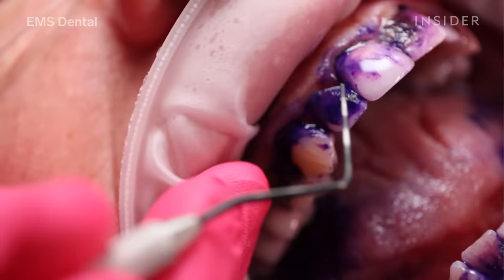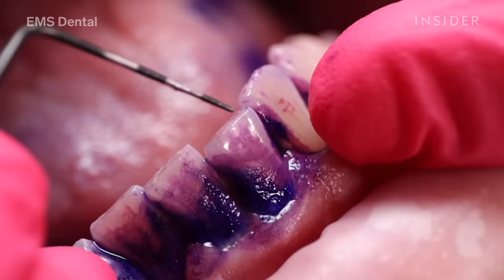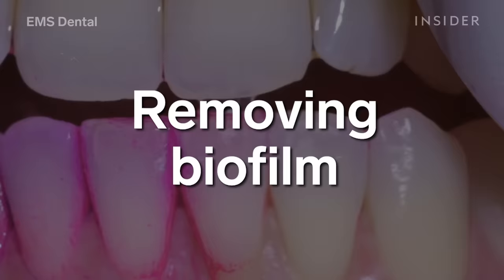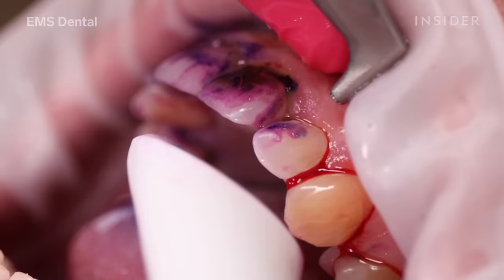The patient is shown in the mirror the stained biofilm. Biofilms are microscopic, whereas plaque is a biofilm that's matured and is large enough to be seen with the naked eye. Ideally, what we want is to disrupt dental biofilm before it has the chance to mature into plaque.